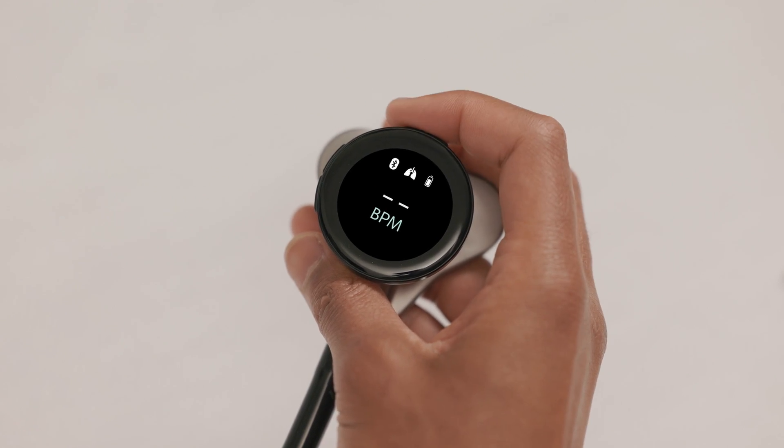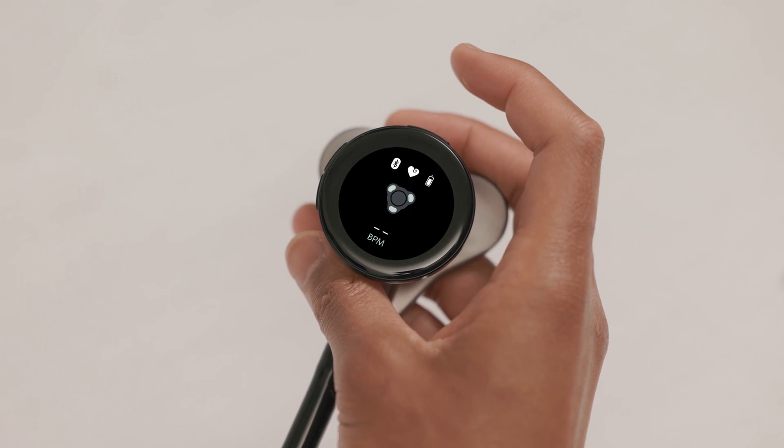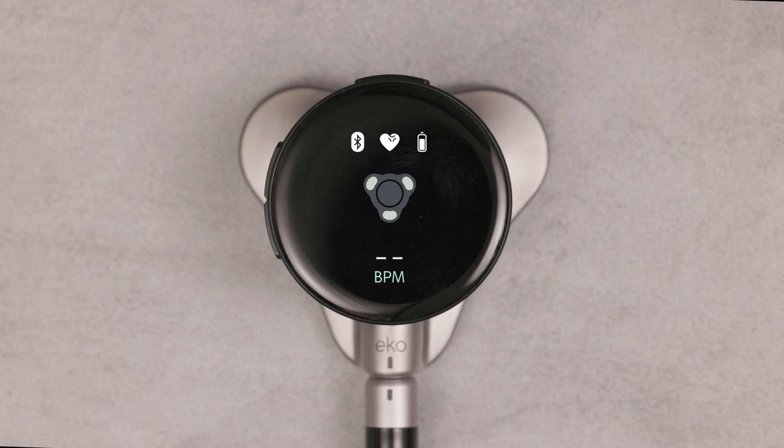Wide is for all use cases. Each filter has been optimized for the unique frequency of these sounds. We recommend using the wide filter first because it has the widest bandwidth for all body sounds. Then the cardiac and pulmonary filters can be selected to focus on specific sounds for those use cases. Finally, in the middle is the lead indicator, which is used for ECG.